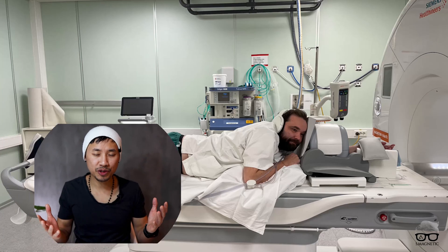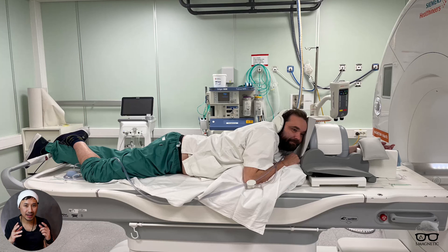Elbow imaging can be difficult — I think the most difficult part is how you're going to position your patient, because there is no dedicated elbow coil like there is for the knee. With the knee, you have a dedicated coil and can position the patient easily, but for the elbow it's a little bit different. I'm going to show three variations and rate them from least comfortable to most comfortable.